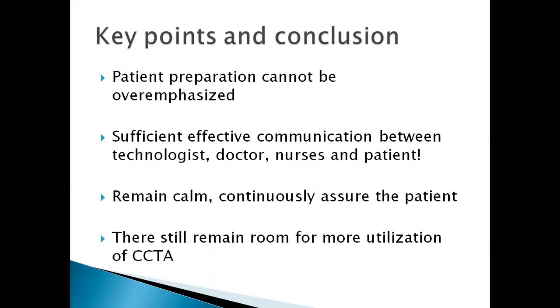Patient preparation cannot be overemphasized, in order to make sure that your temporal resolution is optimum, your contrast resolution is optimum, your spatial resolution is optimum. You need to communicate to the patient, to the doctor, and to the nurse that is actually in charge of the patient. And the patient has to be calm. If the patient is scared, take your time to make sure that the patient calms down before you go ahead and do the examination.